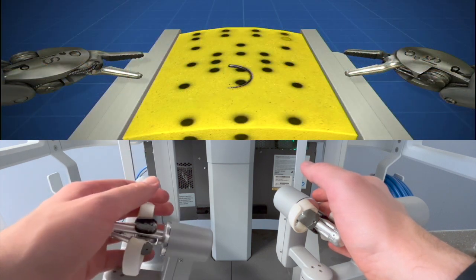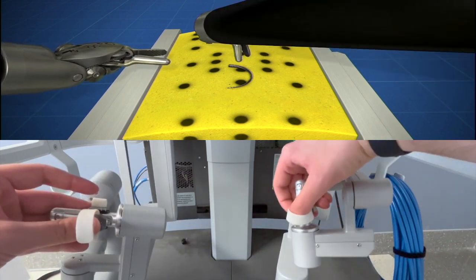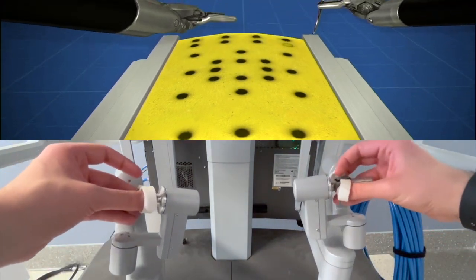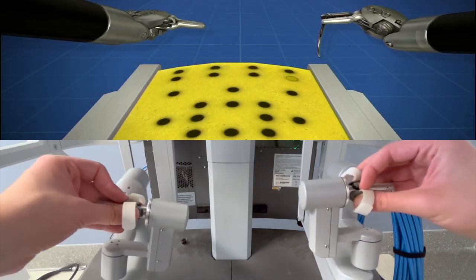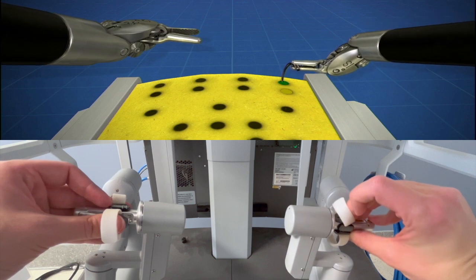This is a very simple exercise. It's an exercise on needle driving, so it practices your needle point awareness. I don't think it's necessarily the most useful of the needle driving exercises, but it's certainly one of the most useful ones in general.